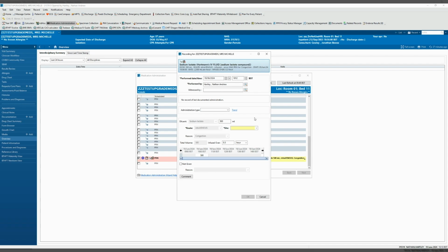So this works in the same way if you scan a medication such as a controlled drug, which requires documentation of additional details. You would simply scan the medication and then click its results column as just demonstrated to open this screen. So in this tab, follow the local medicines policy to document the required information. If this was a drug that required administration witness, for example, if it was a controlled drug, you would need to ensure that you administer the medication with a witness and countersign the order by the witness in this box here.